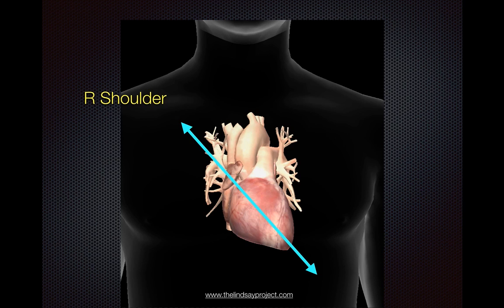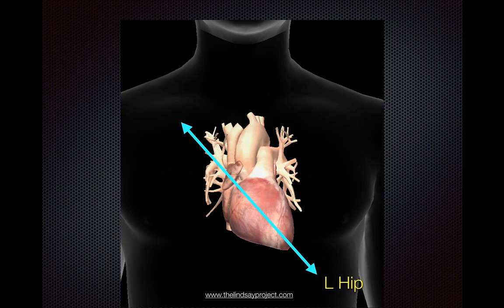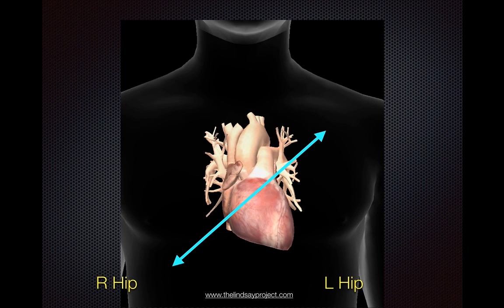As you recall when we were obtaining a parasternal long axis, we were pointing the transducer marker either to the right shoulder or to the left hip depending on what convention you were using. Under the cardiology convention, the transducer marker points towards the patient's right shoulder, and then to get a short axis from that, all you have to do is rotate the transducer 90 degrees clockwise and point it towards the left shoulder. Alternatively, if you had the transducer pointing towards the left hip under the emergency or abdominal setting, you rotate 90 degrees and point it towards the patient's right hip instead.